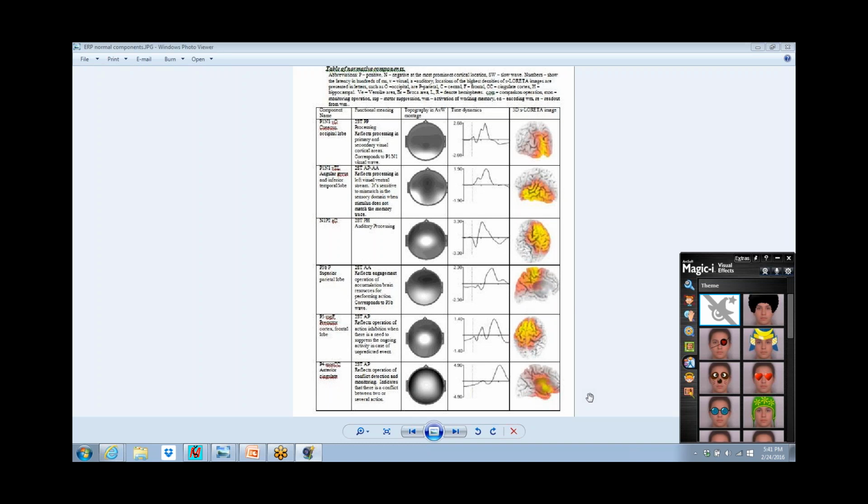Z-scores have strengths, but they have weaknesses too. And when your definition and frequency domain don't match up with the expectation of the database, you're going to get some really screwy advice. So I expressed that concern.